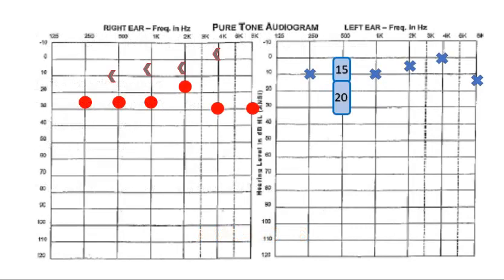Now let's try it with all three of our components, including the occlusion effect, into the formation of our IML. This time we'll include both compensation values. We'll compensate for the hearing level, 15 dB, and the potential occlusion effect at this frequency for this device, which is 20 dB. Finally, we'll add our 10 dB of active masking. So our initial masking level will be a total of 45 dB narrowband noise.